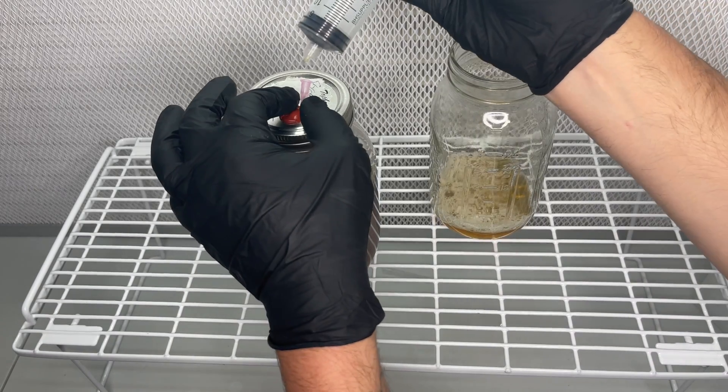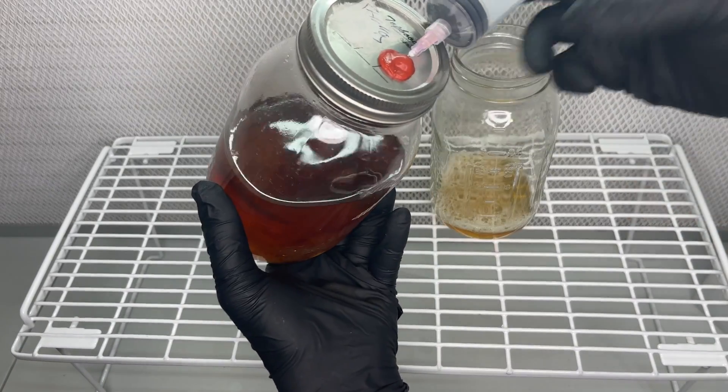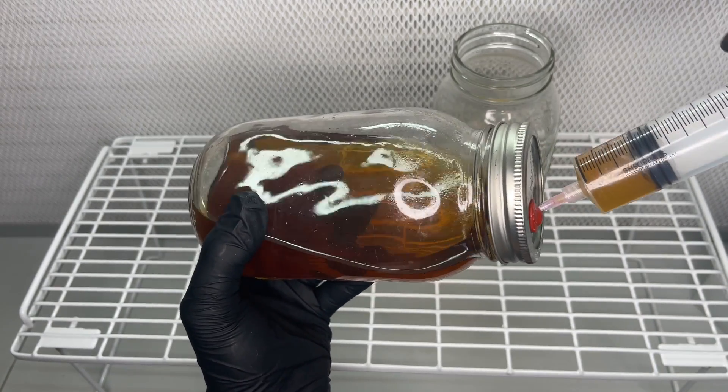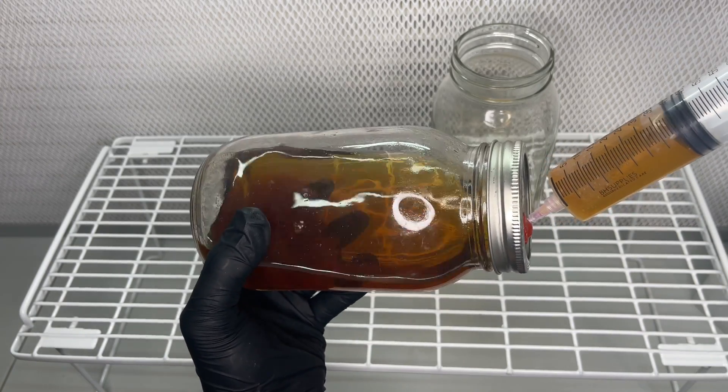But in this experiment I take it one step further and extract the excess liquid and replace it with new sterilized honey water. This experiment will help me determine if swapping out the nutrient liquid will kick start the mycelium and allow it to keep growing.